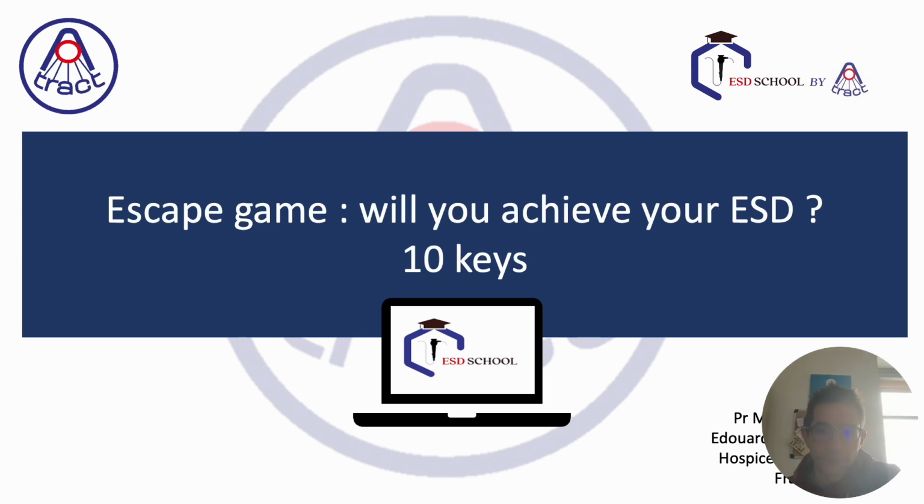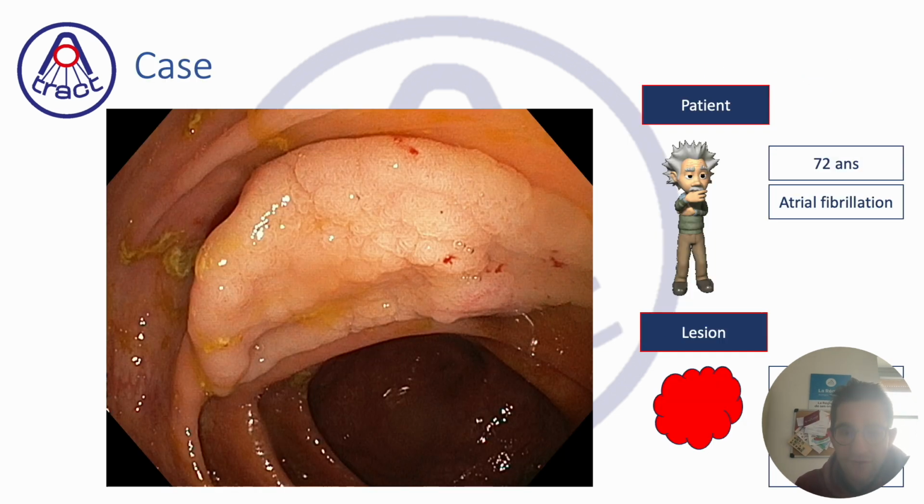So, thank you for being here. We will do a different episode from usual. We will go into a case of ESD in the colon and try to escape from this case with a lot of key points that are, I think, very important to deal with this kind of lesion.